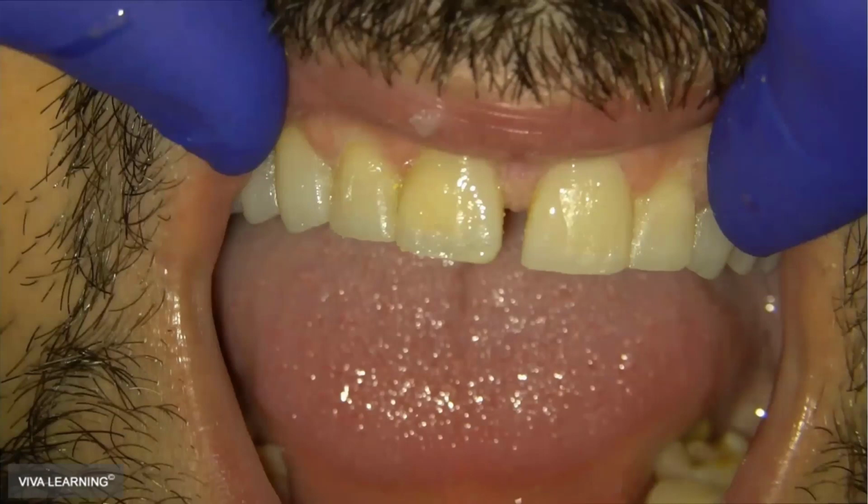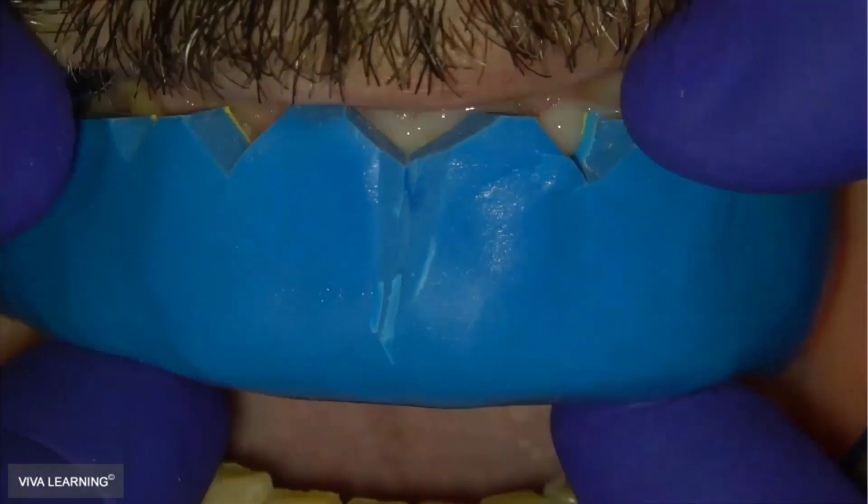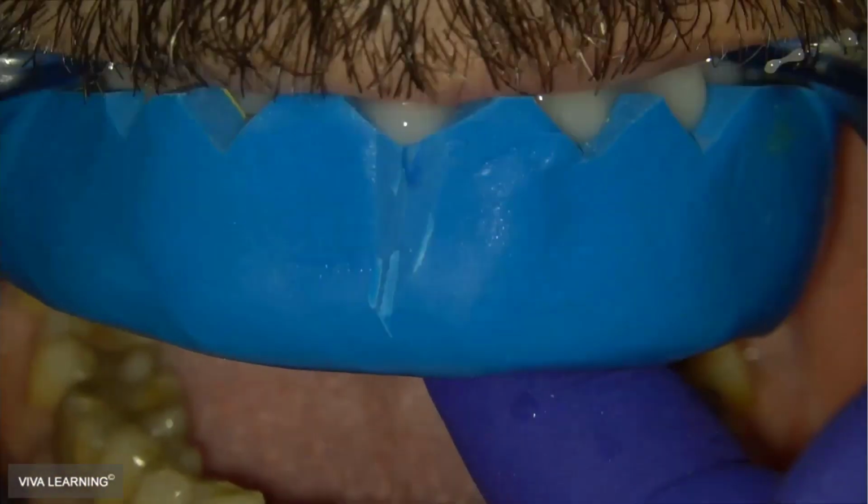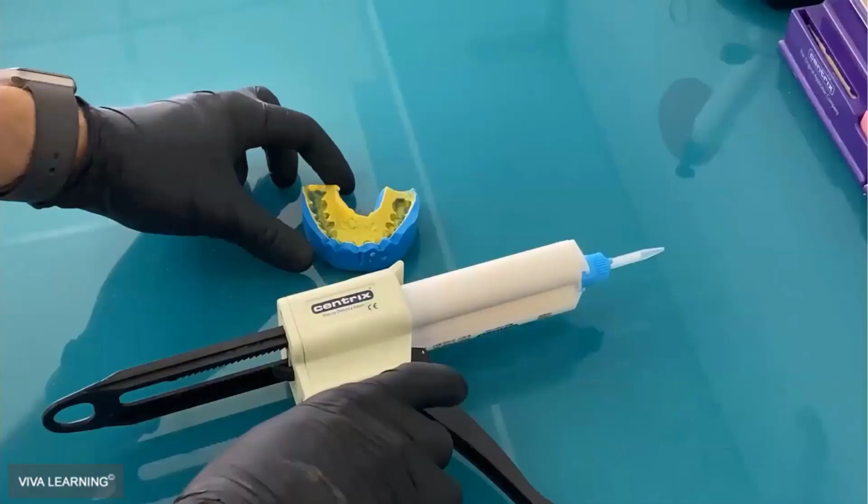And this is very helpful in choosing the right shape and to understand what the main requests of the patient are. Next slide.